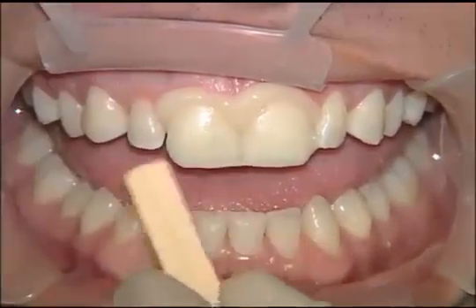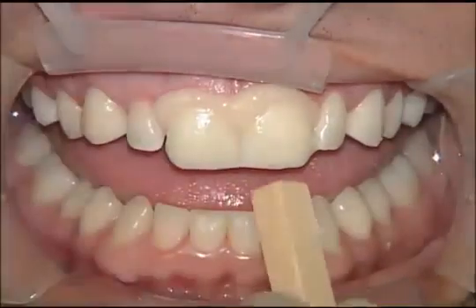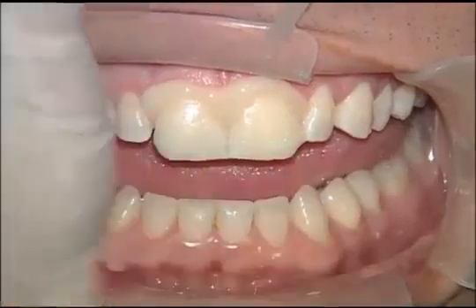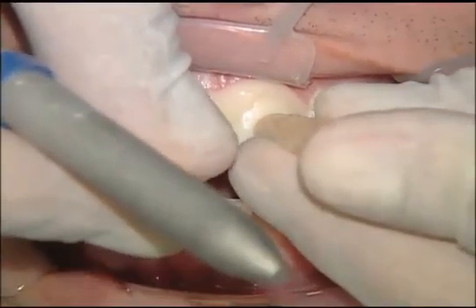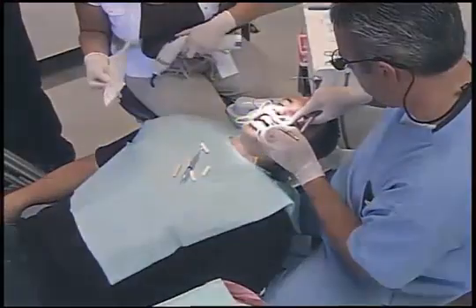I'm using an orange wood stick here, typically on the incisal edge and the facial surface, to make sure that the veneer is seated all the way. And again, using an orange wood stick is kind of a level to make sure the incisal edges are level as well. Typically with a good fit on your veneers, that's not a problem, and they should fit the teeth just as well as they fit the model.